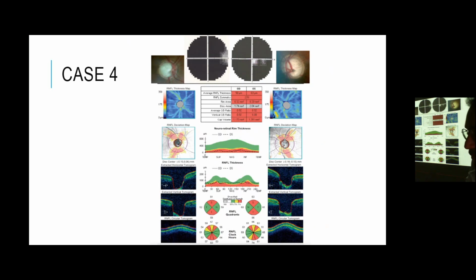Okay. So take this. Yes, sir. So first comment on the disc. So the patient has a large cup-to-disc ratio. Maybe in the right eye there is function. I have to see the visual field indices to see if this is reliable. Yeah, just to give you an idea. And global. Yeah.